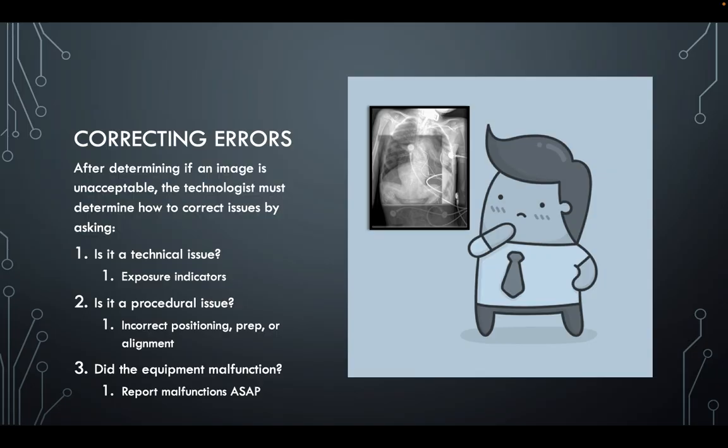Just a bit of advice too, if you are doing a knee or an elbow or something where you have to get condyles overlying, or you really are trying to get parts into alignment with each other, for your patient instructions, tell them to hold still until you let them know it's okay to move. We'll use a knee as an example.